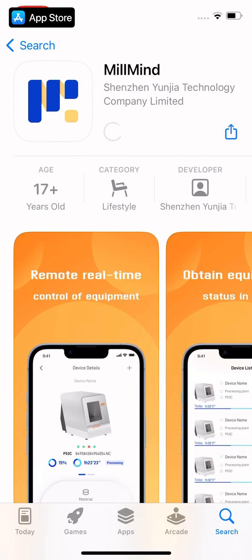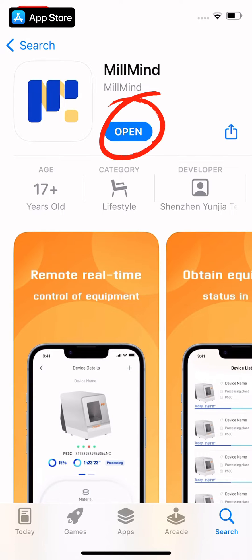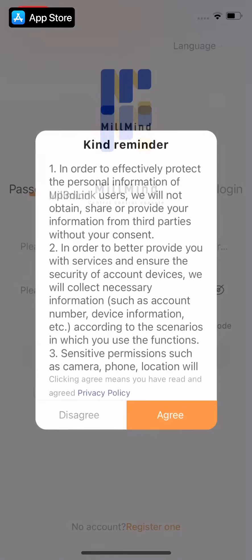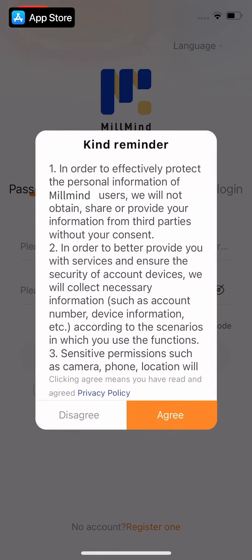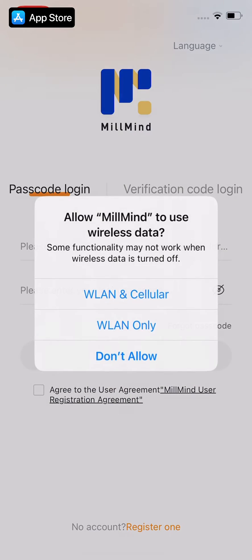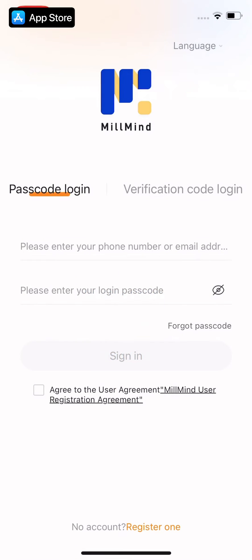When the download is complete, click open. Click allow to allow the software to send you notifications, then click agree to agree to our user agreement. Click on Wi-Fi and cellular to allow the software to use the network. The software is installed.